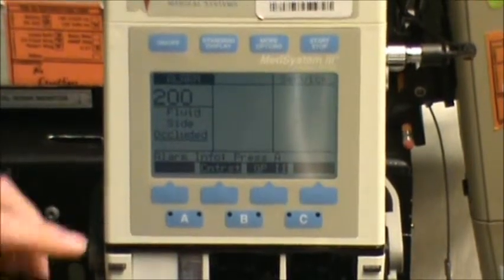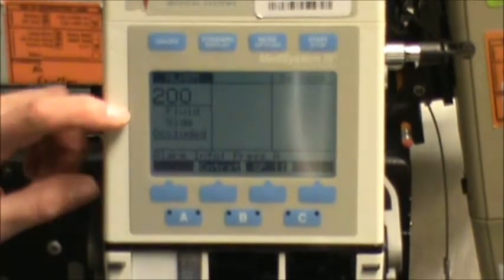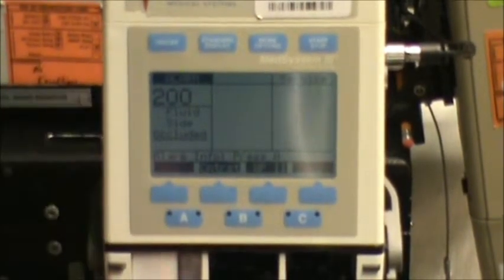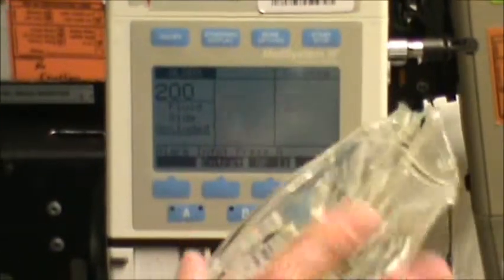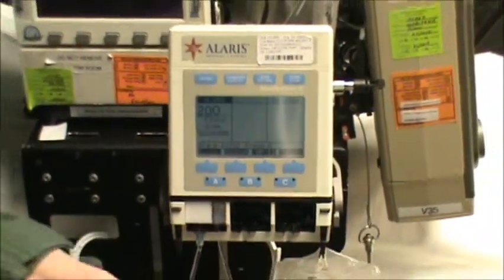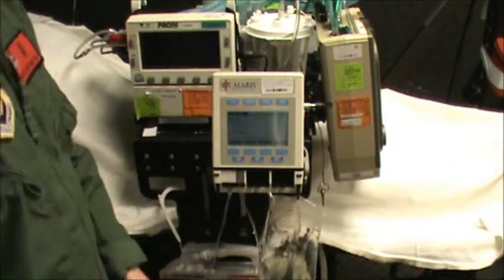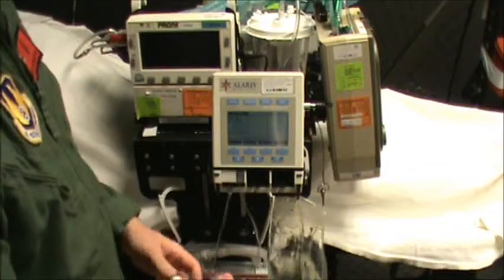During this training we're going to go over the fluid side occluded alarm. With the fluid side, meaning anything from the cartridge to the bag of fluid itself. Looking at this short piece of tubing, it could be kinked, it could have fallen over, or if there's a clamp or something it might be clamped.